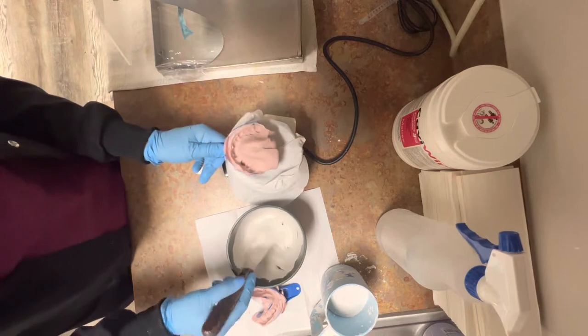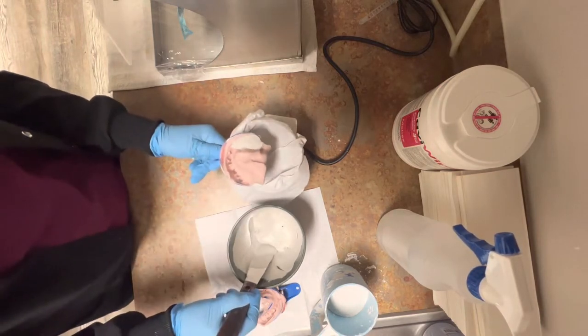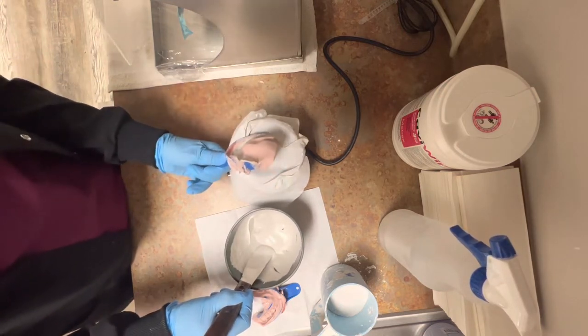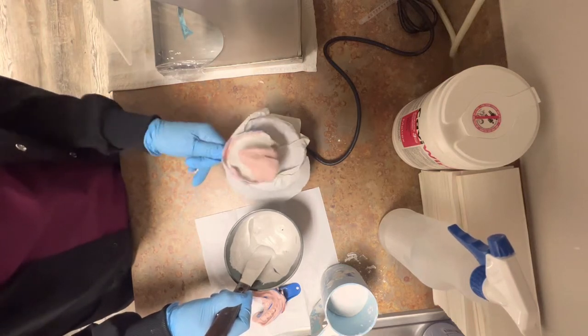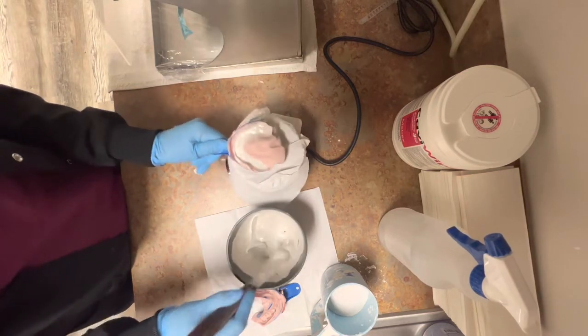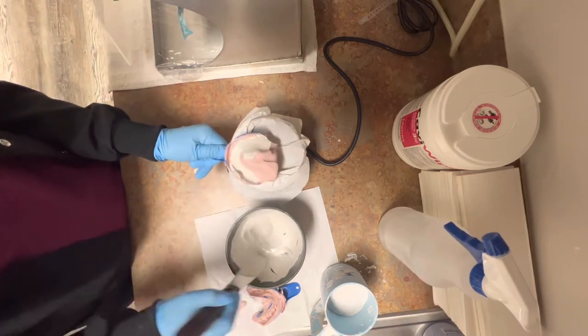Now that I got the consistency I wanted, I'm going to start placing a small amount of stone on the distal ends of the arch. As you can see, it's going to work its way around the entire arch. This is going to be my first space. I want to make sure there's no air bubbles. If you see an air bubble, that means you have to continue vibrating this impression.